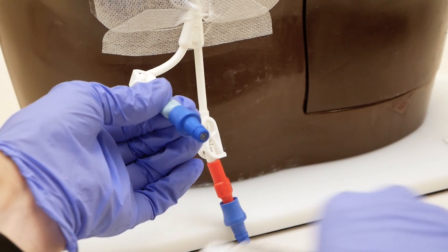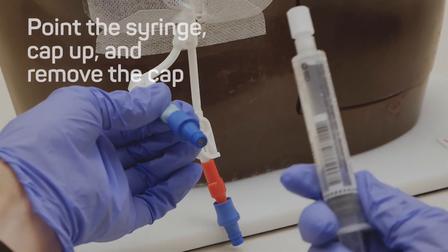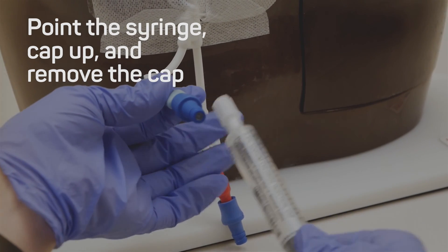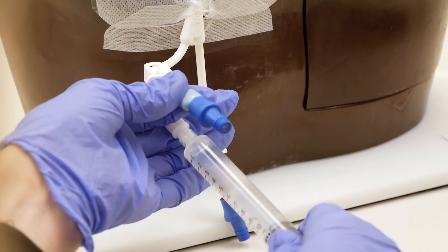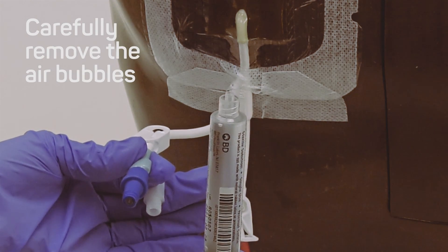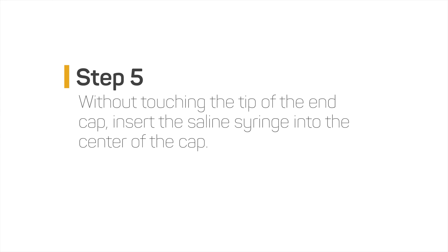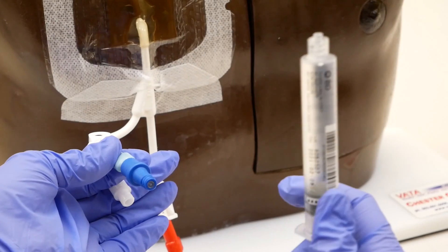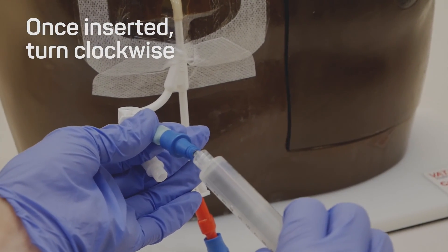Step four: prepare one saline syringe, point the syringe cap up and remove the cap. Step five: without touching the tip of the end cap insert the saline syringe into the center of the cap. Once inserted turn clockwise.